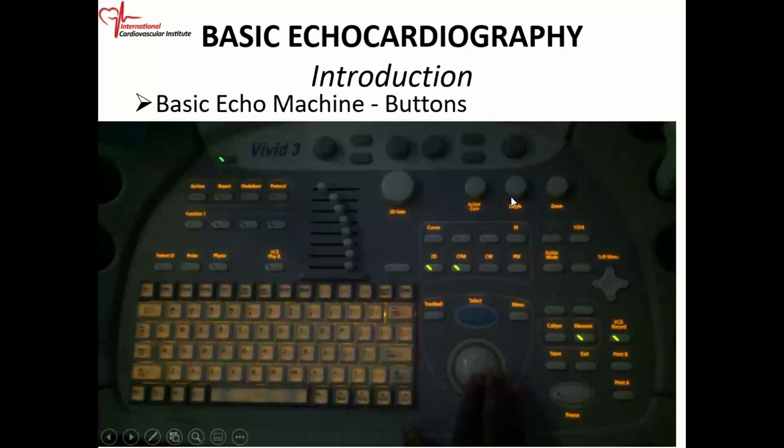And then there's a zoom knob. With this zoom knob, you can increase the size of the image, because sometimes you want to increase the size of the image, especially if you're going to do measurements. And then the depth: if you decrease the depth, you're going to increase the size of the image. So you can change the size of the image depending on the depth. And then these are gains. When we say gain, it basically makes the image look brighter or duller.